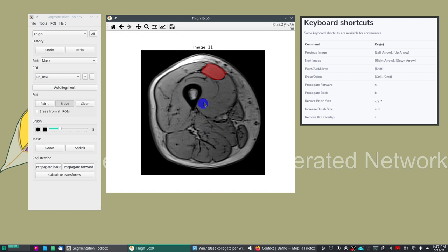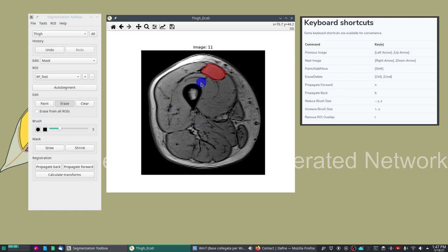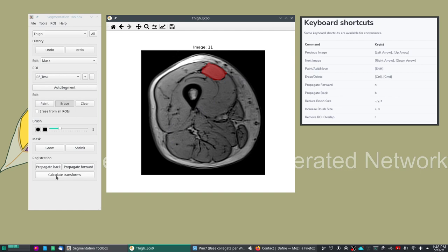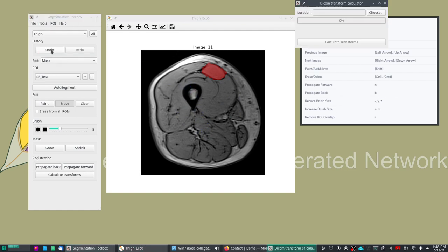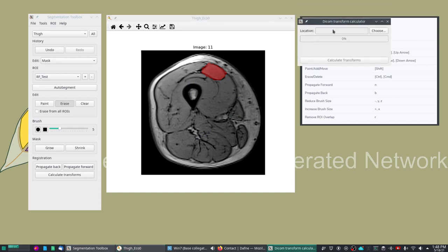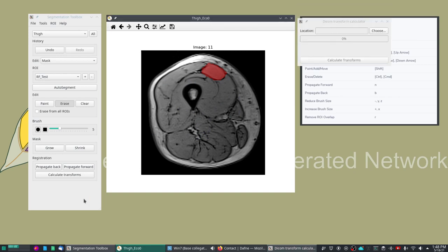This feature uses non-rigid registration to try to find the corresponding features in the neighboring slices and propagate the mask accordingly. This relies on non-rigid registration so in this case I pre-calculated the transformation. If you haven't done so it will take a few seconds to propagate each slice, so I suggest that you use the calculate transform button which will calculate all the transforms and store them permanently on disk.